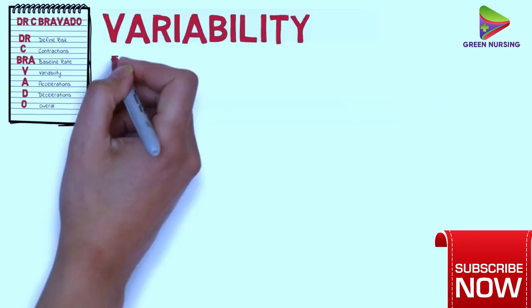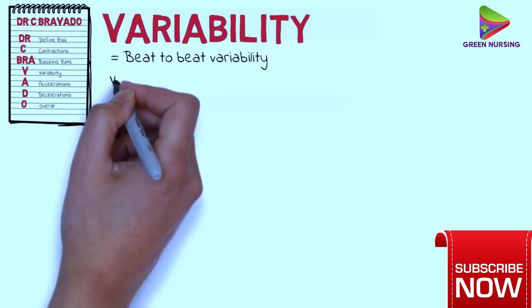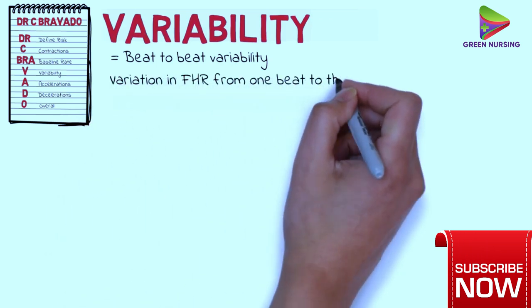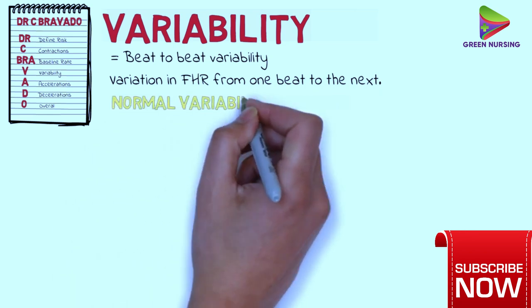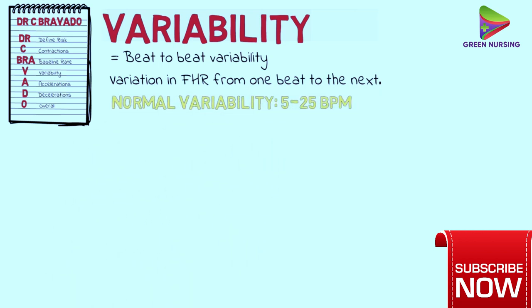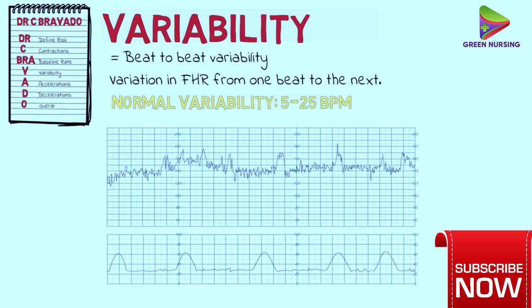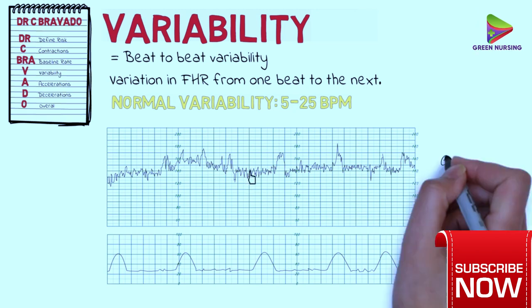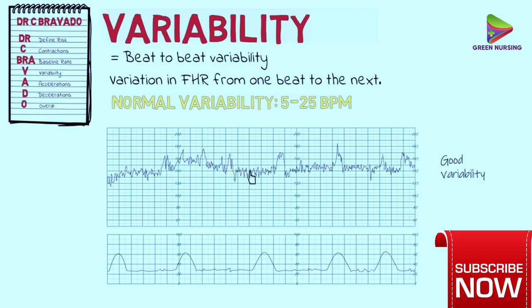So next we've got variability, also referred to as beat-to-beat variability, which is the variation in the fetal heart rate from one beat to the next. The normal variability range is from 5 to 25 beats per minute. Looking at this CTG, we're looking at how much the trace is moving up and down along the baseline. This CTG has good beat-to-beat variability, certainly greater than 5 beats per minute. Normal variability indicates an intact neurological system in the fetus, and is a good indicator of how healthy a fetus is.